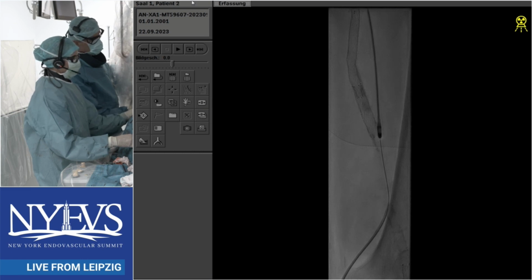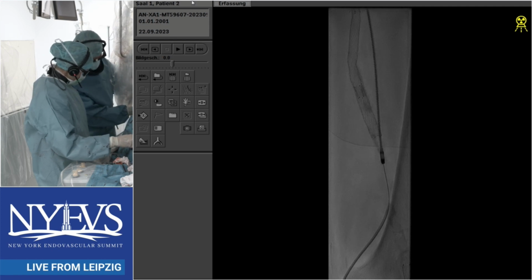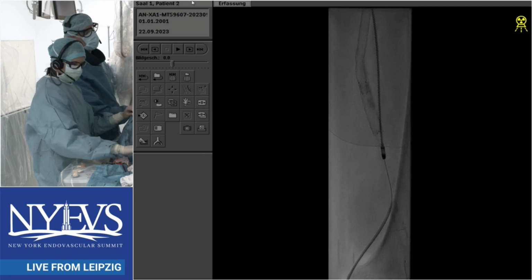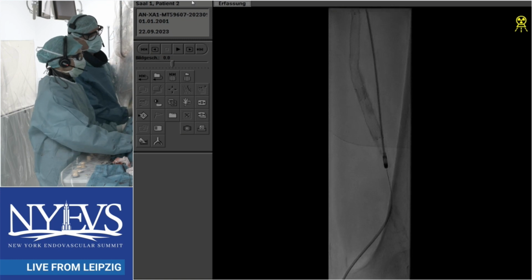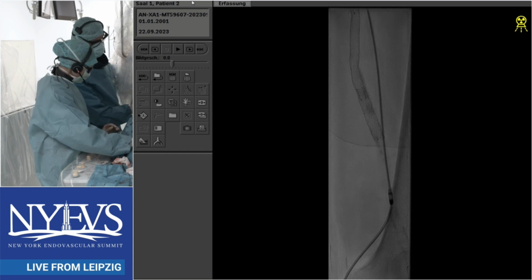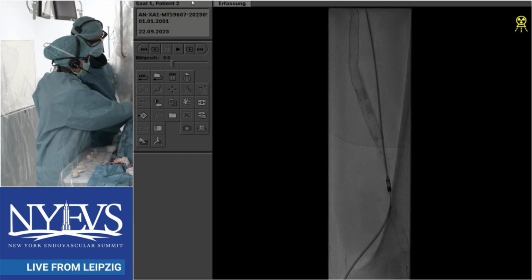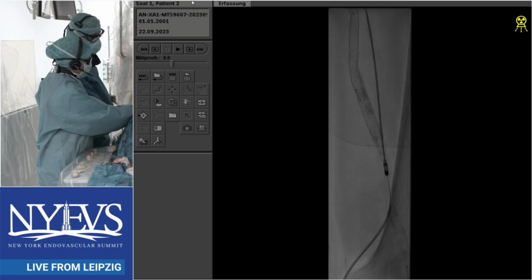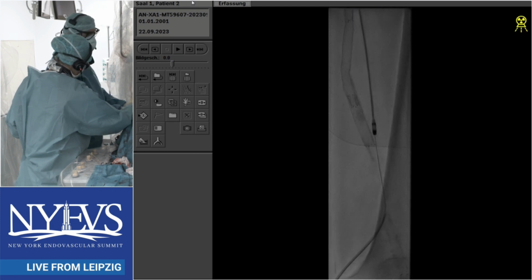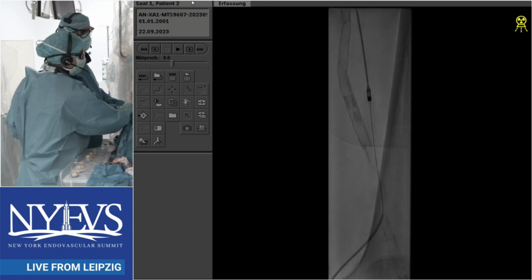So, just going down the panel, if you can pick one device that you like to use for ISR, what do you pick? Start with PK. For me, it's Rotarex right now. Kumar, I do laser. Christian: if it's early, percutaneous thrombectomy and then a DCB, and if it's late, laser or Rotarex and DCB. Laser. For me, Phoenix or Jetstream. Primarily Jetstream with both blades up and blades down, unless it's acute, then I'll go in with lytics and aspiration.